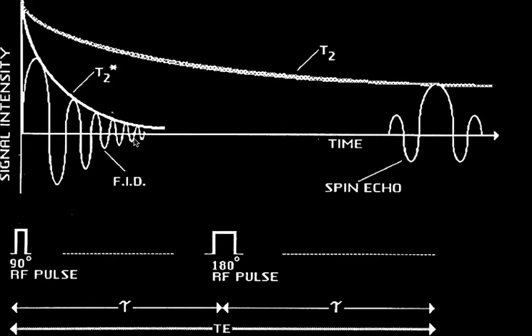Another question. The one thing conceptually I'm having a little bit of an issue with is, what's going on here? Once you put the 180 pulse in and you're waiting for your echo to come back, is this a phenomenon that happens, a signal at 2 times tau, that the echo comes back? That's just a phenomenon that happens. You're sitting there waiting, sampling for it, and then it hits your coil and it records it.